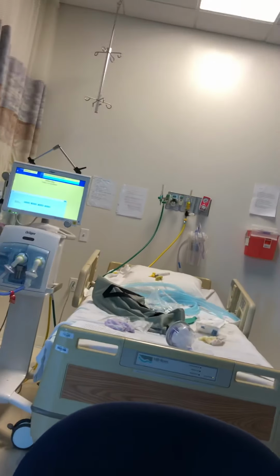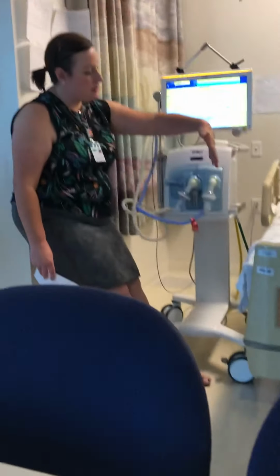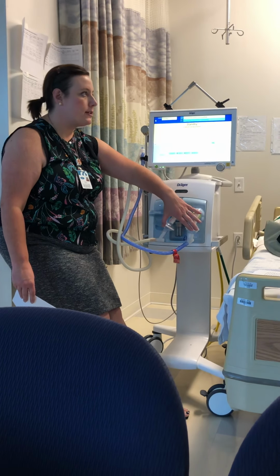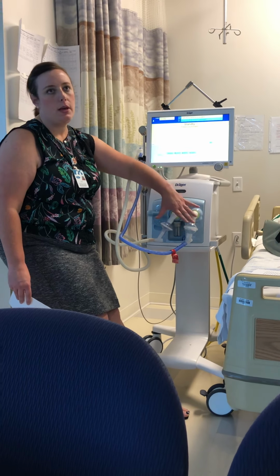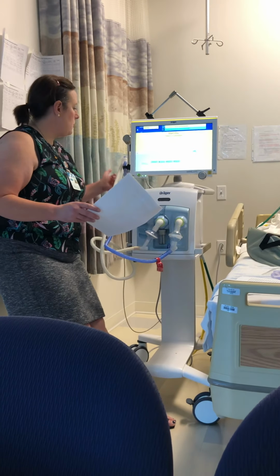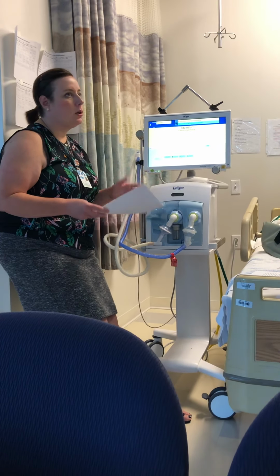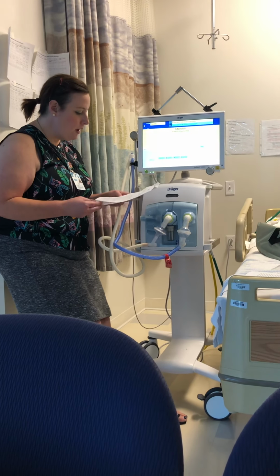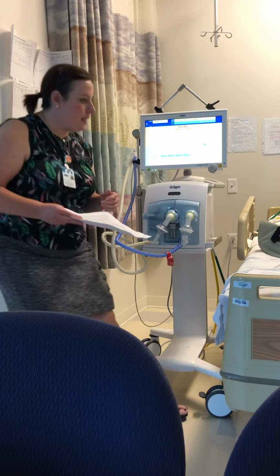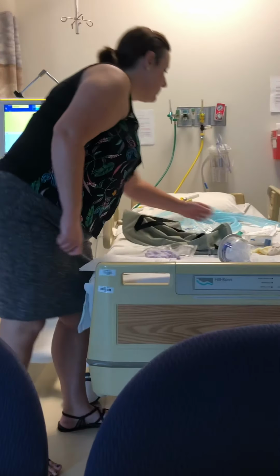So there will be a heater on here for the next time, but this vent labels inspiratory and expiratory limbs. We'll use this double filter process. Not all hospitals do that, but for our purposes, we'll do that for our lab. It'll be hooked up into the actual heater wires as well. You'll have to plug them in and then get the neonate supplies.